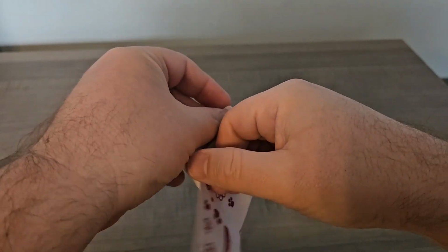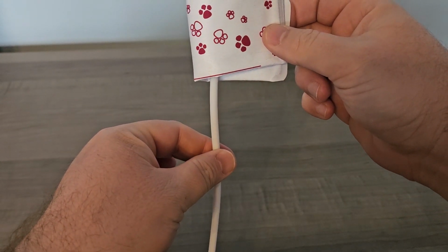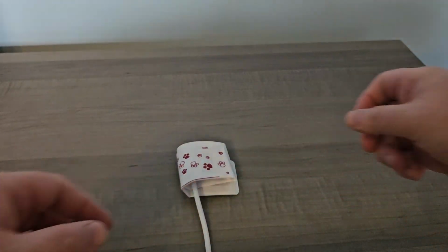When taping to the patient, the hose should align with the vessel you are attempting to measure. When on a limb, this will be the under or back side of the limb.